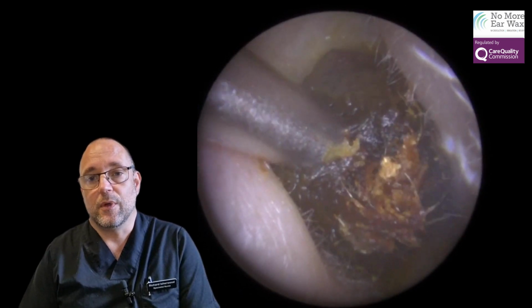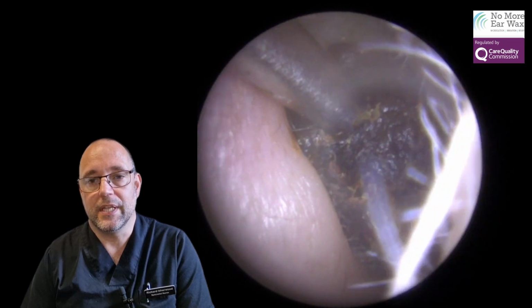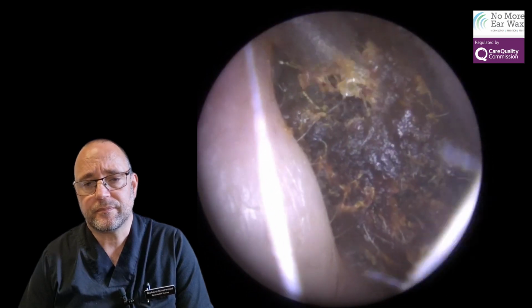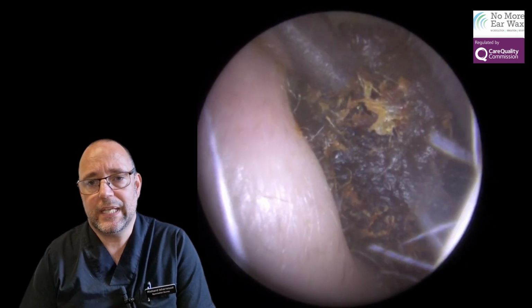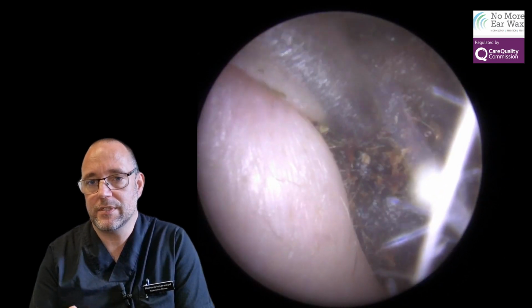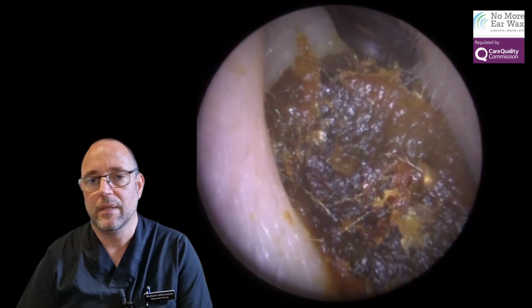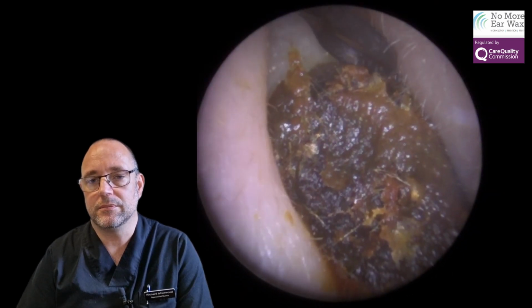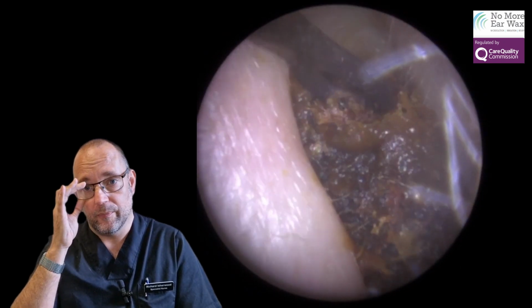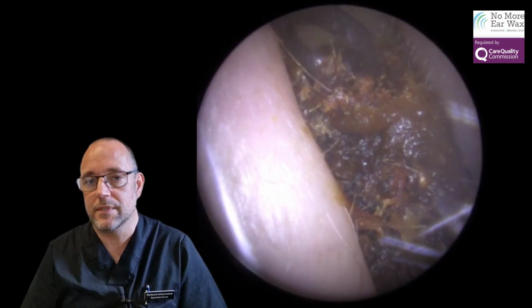But as you can see, this other one was an absolute monster, as you can see from the size of this thing here, and it's a horrible consistency. It's kind of sticky, but it is kind of crumbly as well. The first part is quite sticky, but as we work through this bit underneath it, it's quite crumbly. It's really difficult to get this out with the suction, I was finding, because it's quite a narrow exit to the ear canal.